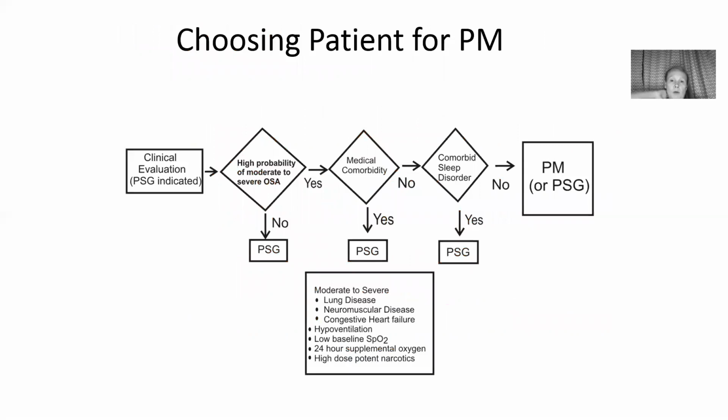Choosing a patient for portable monitoring, all of this information, by the way, that I'm going through, it's all in your fundamentals textbook. This is all in there. I've just reorganized it and am talking you through it here.